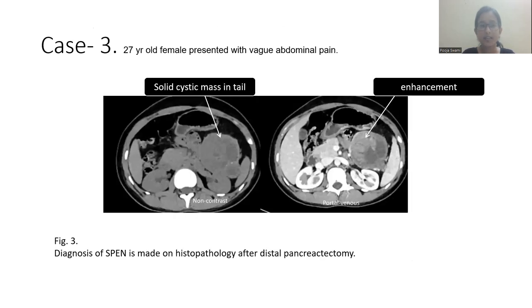Case 3: a 27-year-old female presented with vague abdominal pain. On CT, we can see a solid cystic mass in the tail region. On non-contrast and portal venous phase, it is showing enhancement. The diagnosis of solid pseudopapillary neoplasm was made on histopathology after distal pancreatectomy.